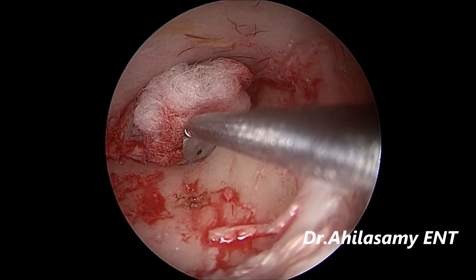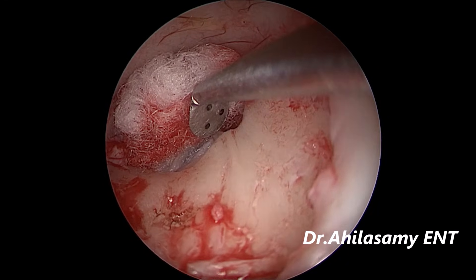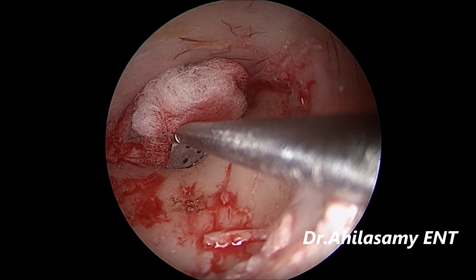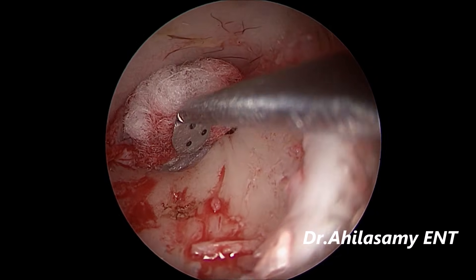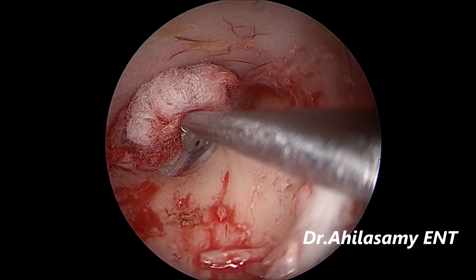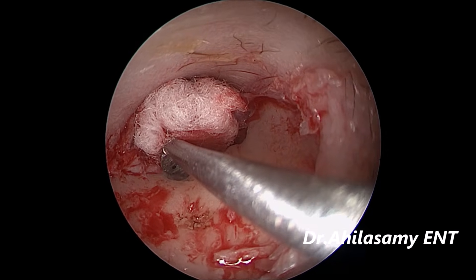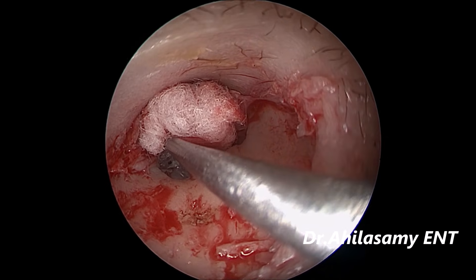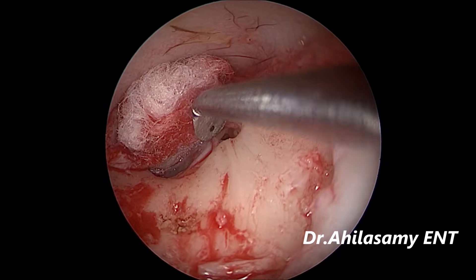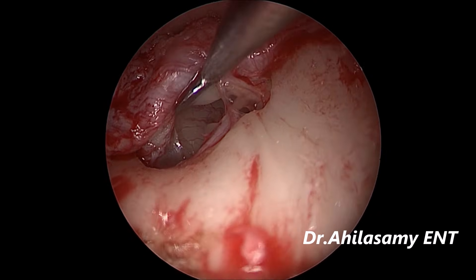Now I am elevating the tympanomeatal flap to enter into the middle ear space. Look at the beauty of the field quality with my innovative instrument. You can do these steps very fast if there is no bleeding like this. Just going to enter the middle ear — the chorda tympani is coming into view. So I am entering the middle ear and opening it.